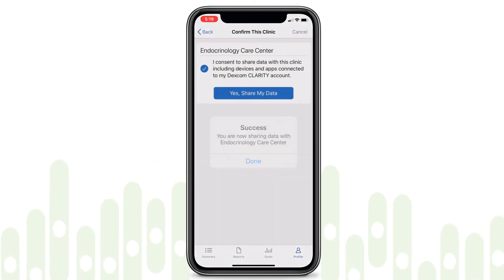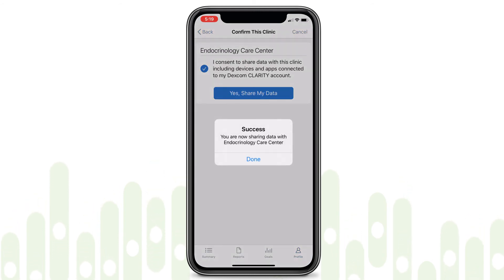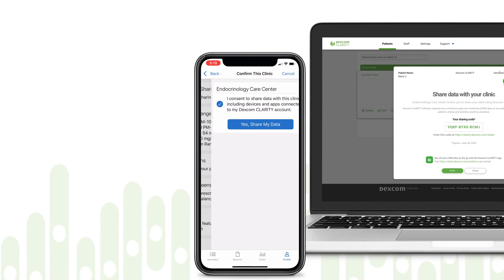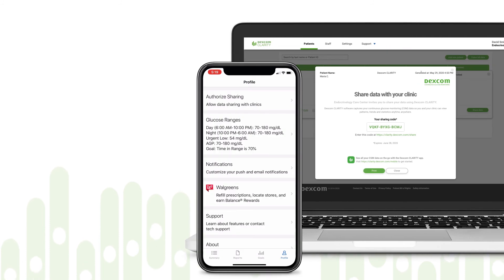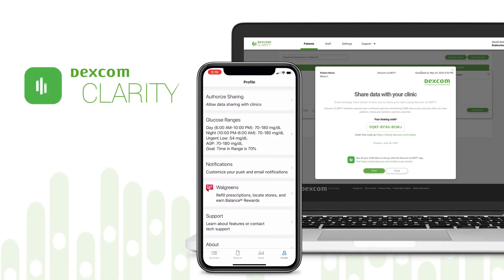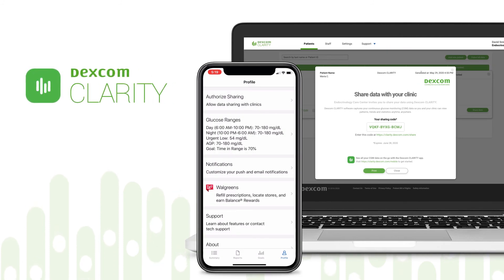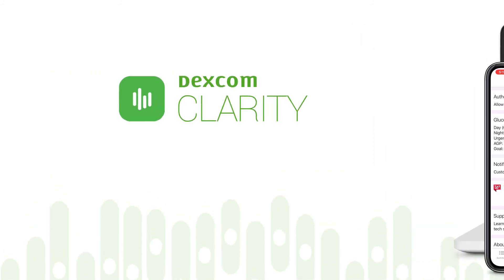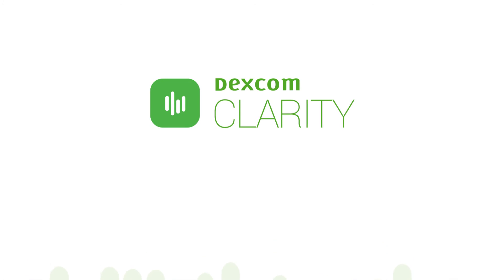Now the patient is sharing their data with your clinic. Encourage them to use the app to receive weekly notifications and track their diabetes management with Dexcom Clarity.